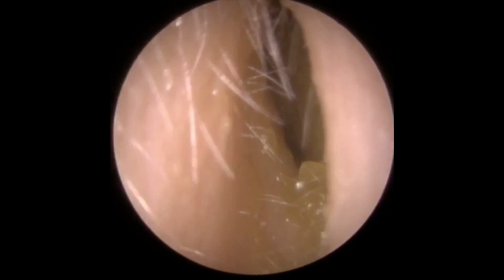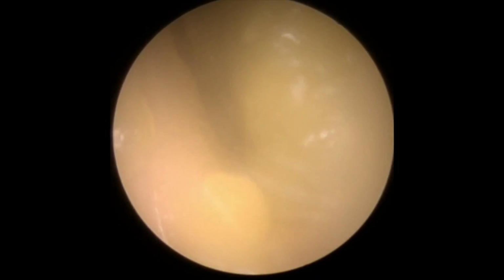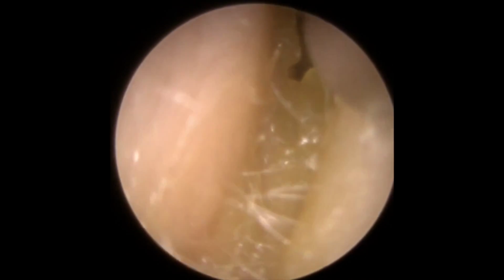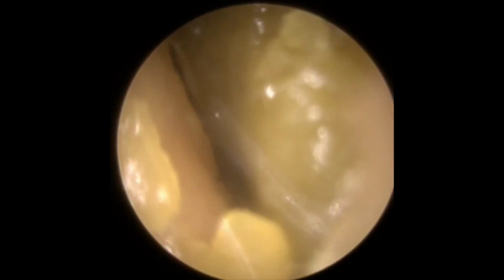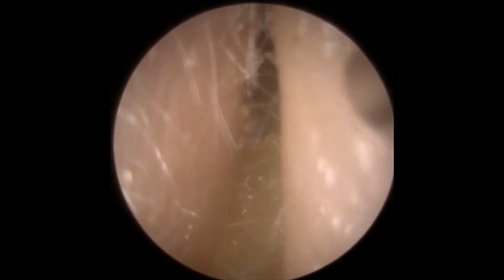So this next patient came through. We have a lot of difficulty here in this particular area where our clinics are based, where the waiting time to get wax removed from the ear is quite long, especially because a lot of the GP surgeries have actually stopped suctioning. So this lady was having her ears cleaned out quite regularly by the local hospital, the ear, nose and throat department, by the consultant, but has had her appointment cancelled quite a few times. So she was having this done roughly about every 6 months, but it's been 18 months since it's been done.